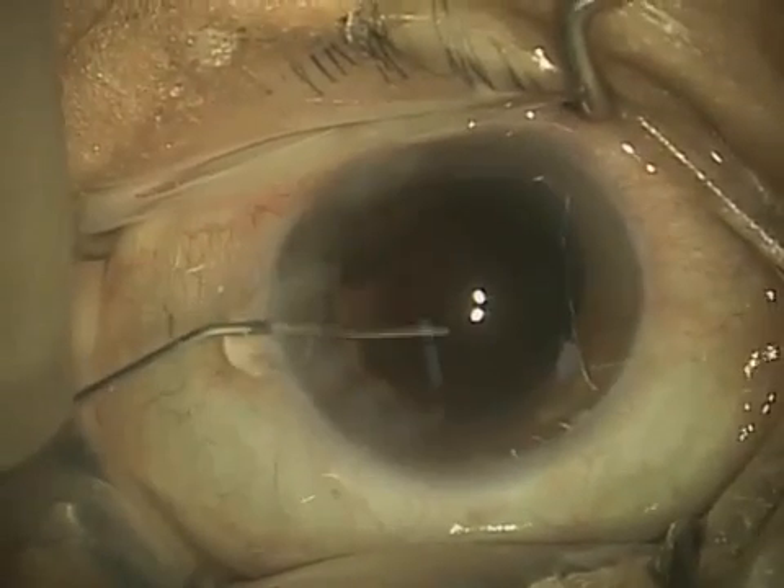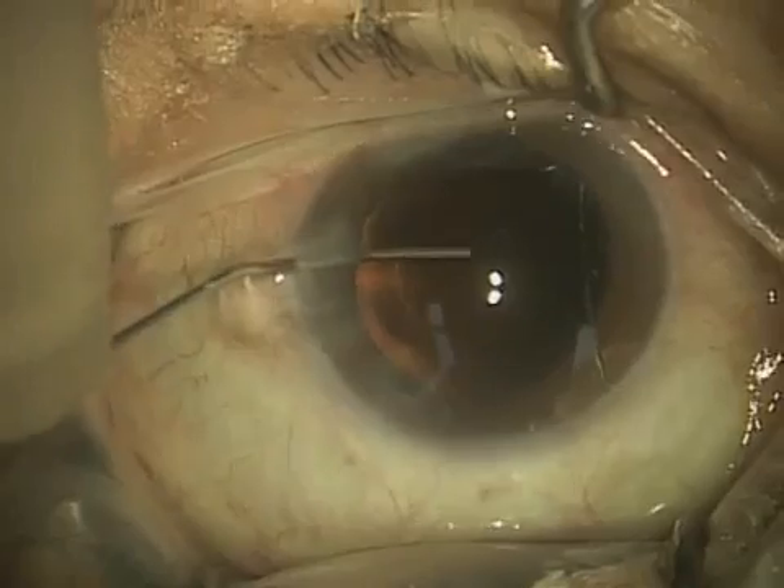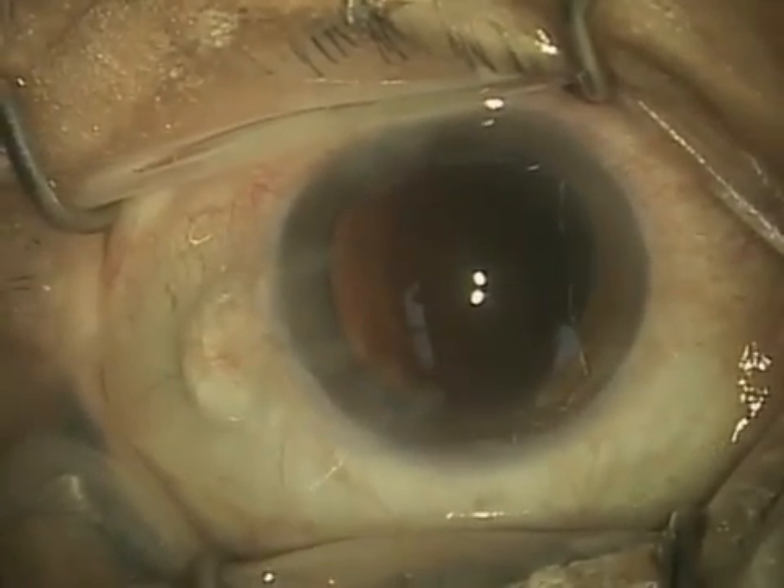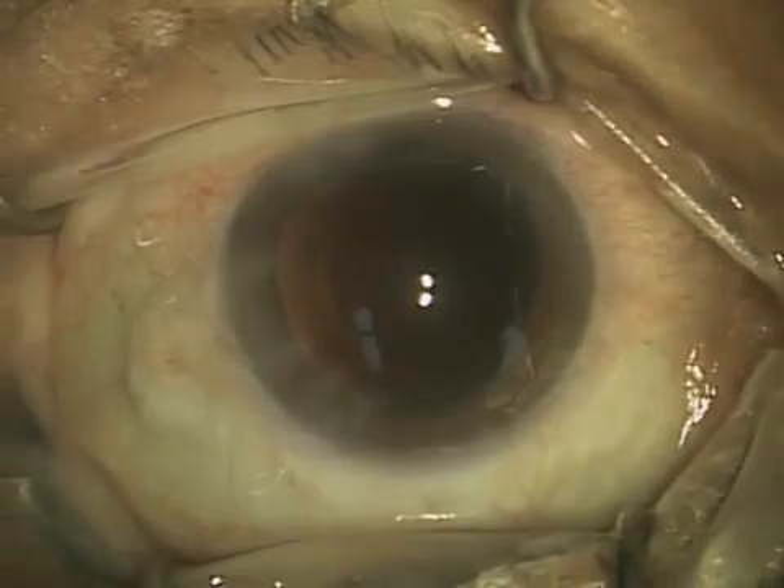Hello again, this is Dr. David Richardson, the cataract coach, and welcome to the fourth and final installment of a typical cataract surgery.